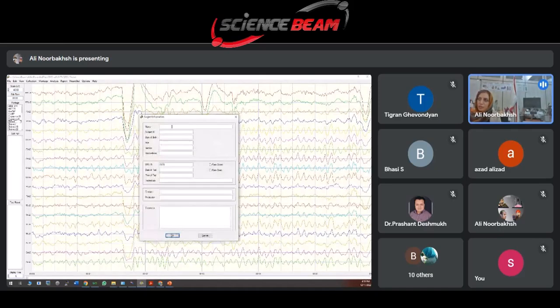And we should fill these parameters: name, age, gender, handedness, and other things. Name is Sally, age 28. The event is eyes open. It's very important.